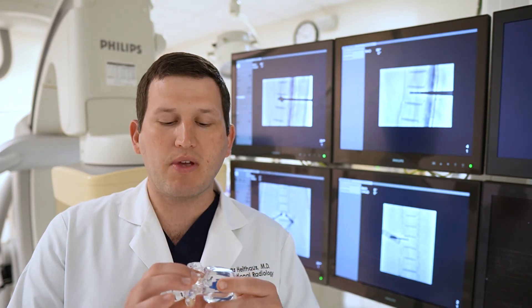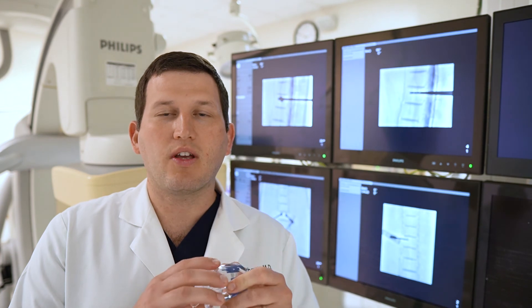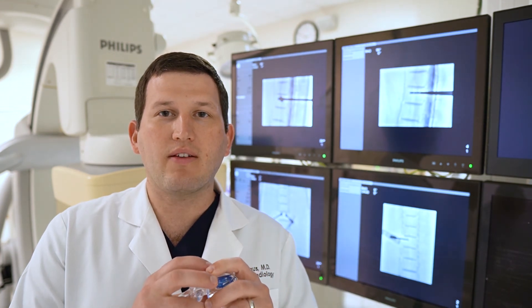This is a minimally invasive therapy done through two small incisions at the back of the spine. Patients are given a mild sedative through their IV, and they often go home within an hour of the procedure. Some patients experience immediate pain relief.